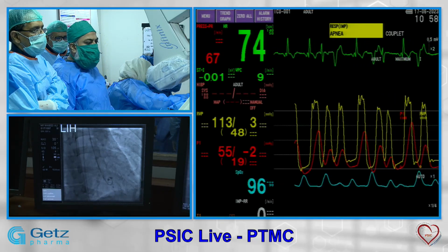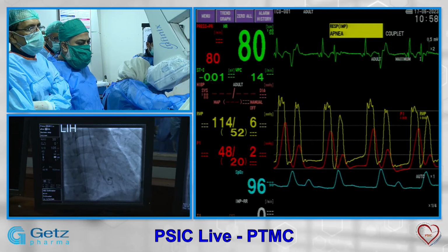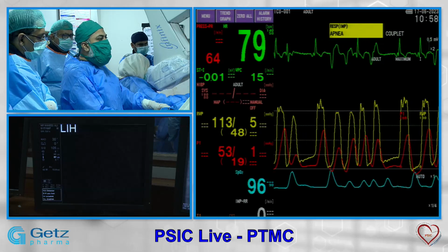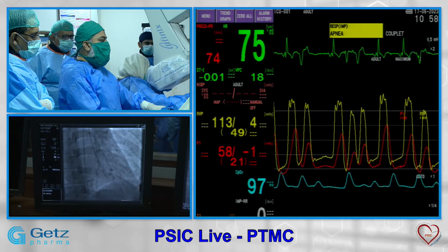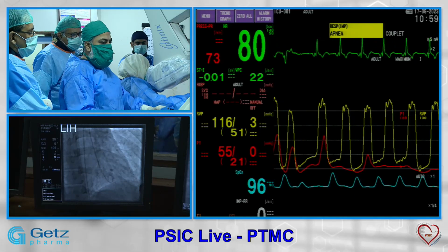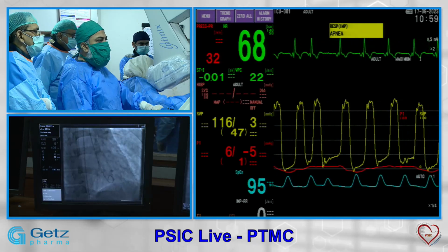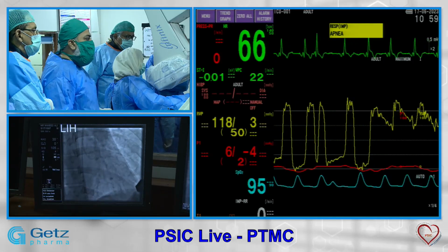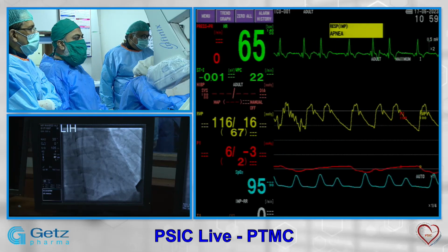So RV pressure has dropped from 85 to 50. These are the immediate results, and we are not usually looking for this much, but this is what we usually see, that the patient gets immediate relief. So EDP has not increased. The EDP is still around 5 to 10. So there is no MR on echo. Dr. Sumaya says everything looks good.